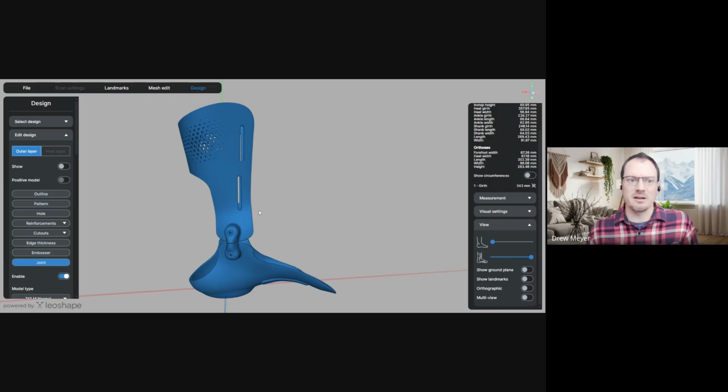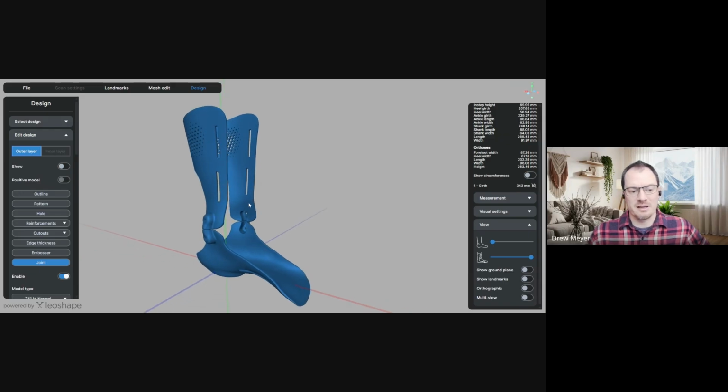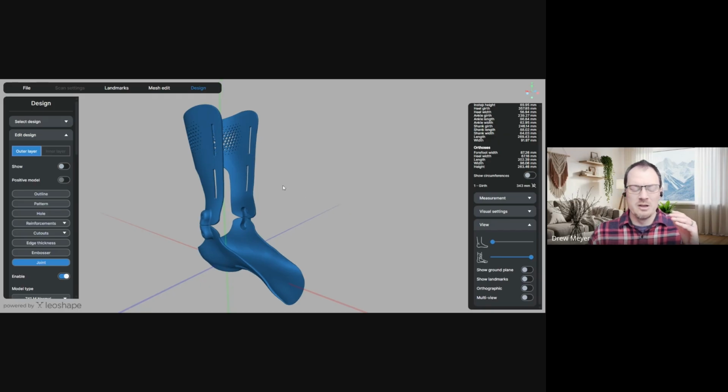But obviously, that technology is a little bit more expensive. Not everybody has access to it. But for those who are in the US, I know Formlabs has recently launched a pay-for-service option where you can basically drag and drop a file and just order a print from them, and their prices are really aggressive and affordable. So if that's something you're interested in learning more about, you can just Google Formlabs.